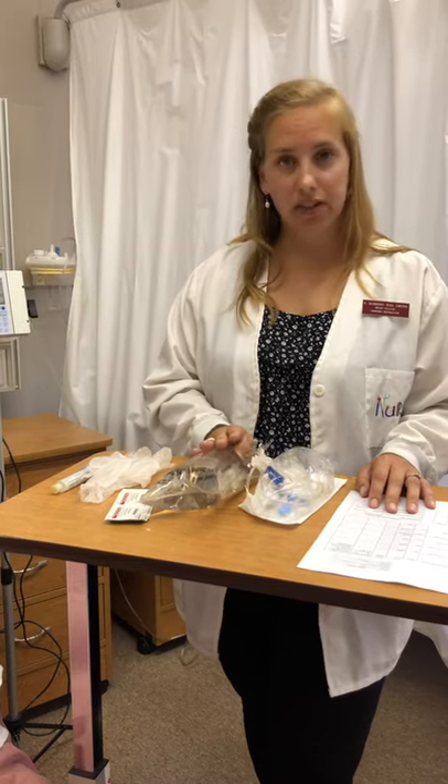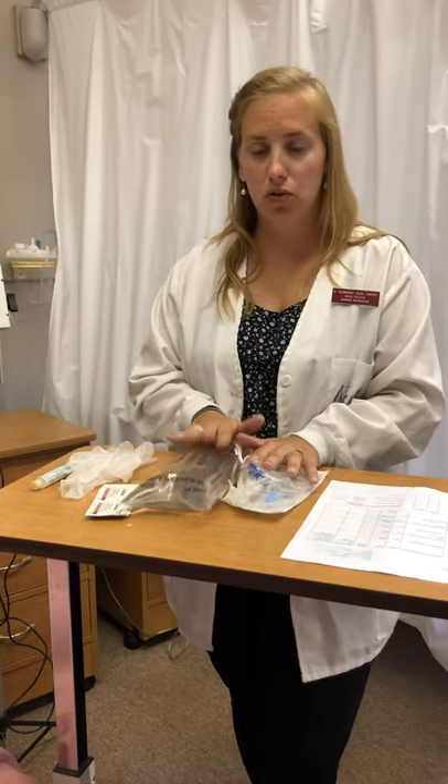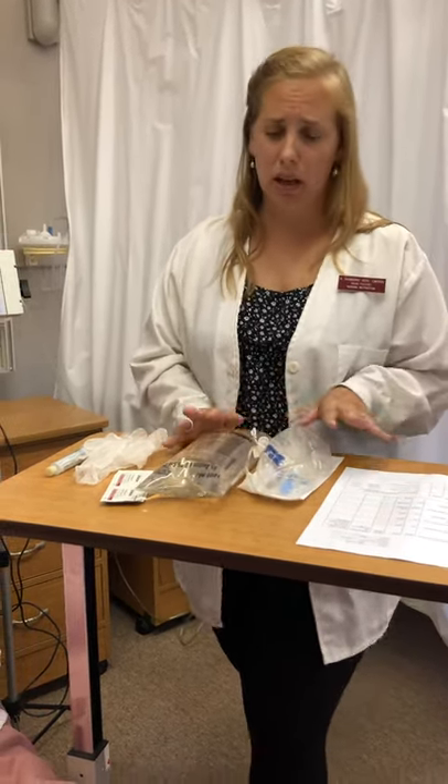When we're giving IV fluids, we treat it like a medication, so we're going to do all our rights and our checks, assess for allergies, and when we go into the room make sure we have the right patient and that the patient is getting the fluids for an appropriate reason. It's important to remember you treat IV fluids just like a medication.